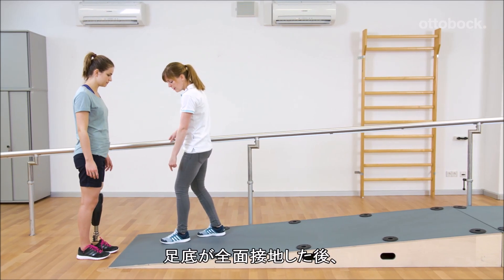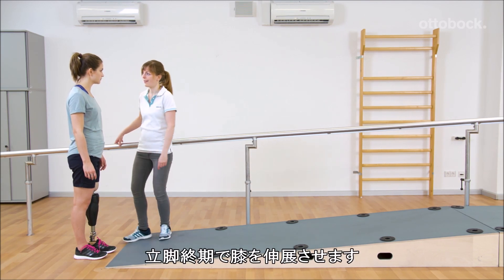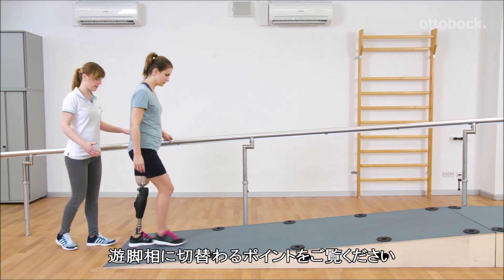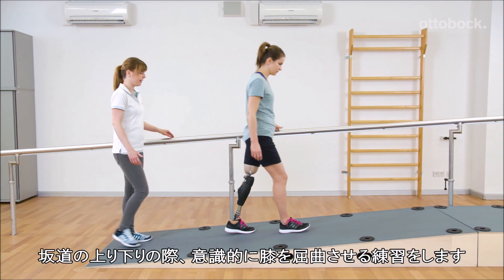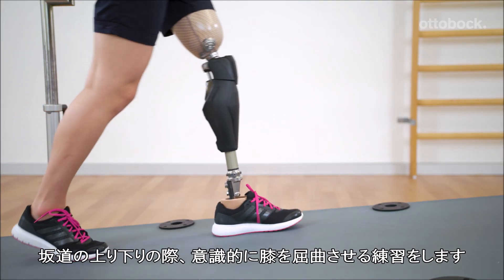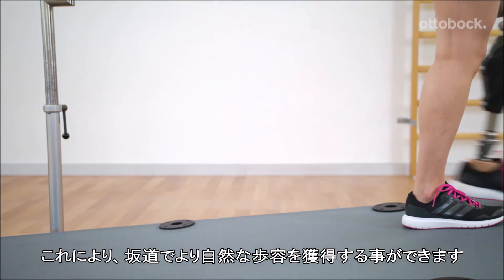After achieving full foot contact, the centre of mass moves forward and generates knee extension in terminal stance, which triggers stance release. When walking uphill and downhill, Reka trains to consciously allow knee flexion and therefore gets closer to a natural gait pattern on slopes.